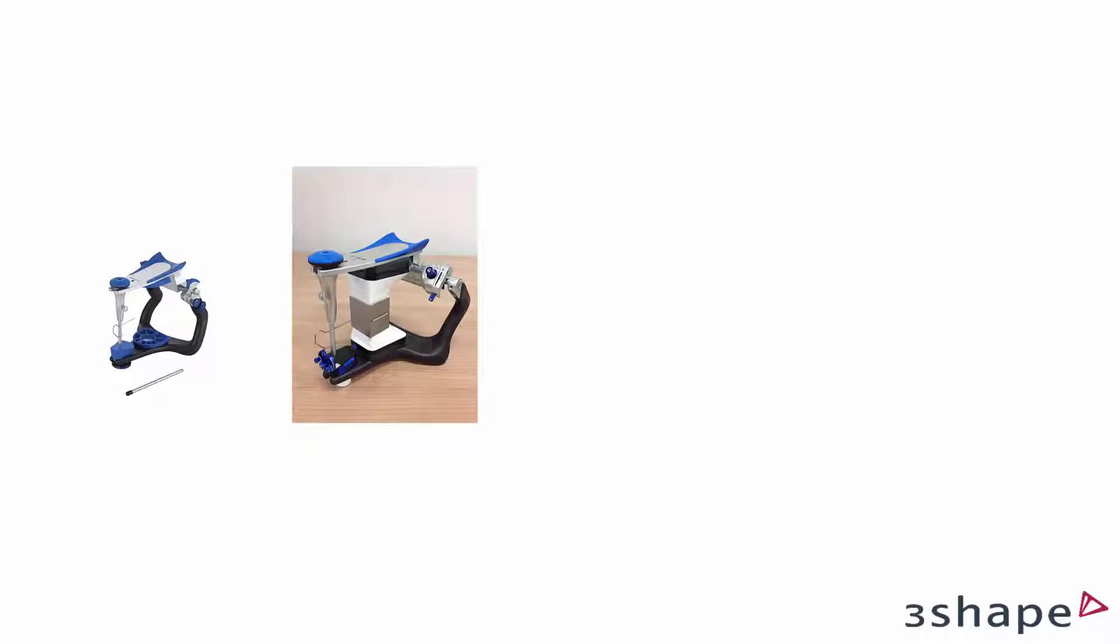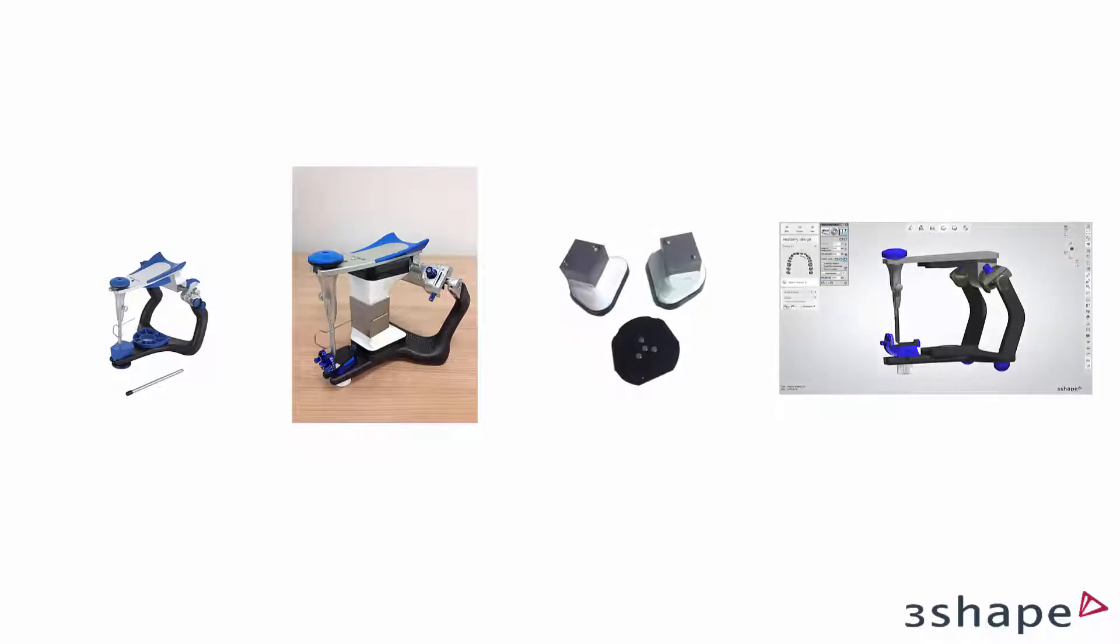You can calibrate your physical articulator with its virtual version by mounting the calibration object in gypsum in the articulator and transferring the object position to transfer plates and then the software. This allows you to transfer the bite in order to skip the bite scan later during scanning any models mounted in the chosen articulator.